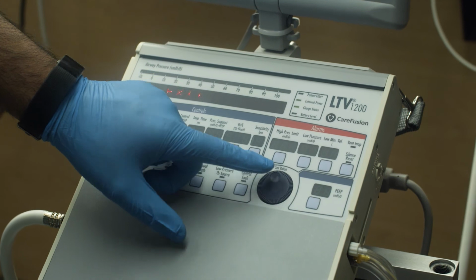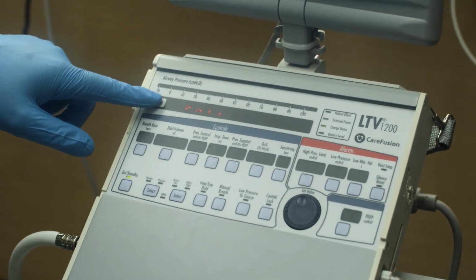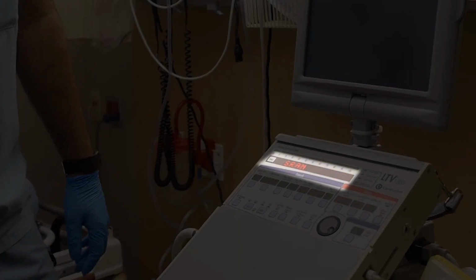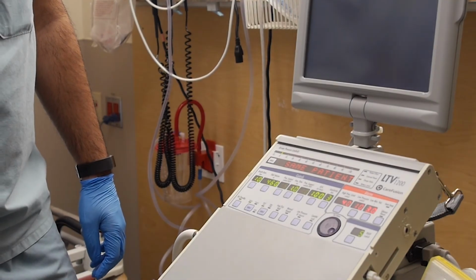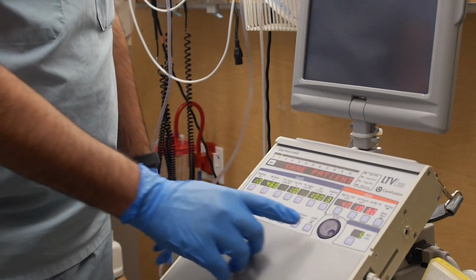Using the dial, navigate to Exit in the menu and press Select. Navigate to Exit in the menu a second time and press Select. You will now see the text Same Patient. Congratulations, you have successfully leak tested your ventilator and managed to return to the initial screen for inputting patient settings.